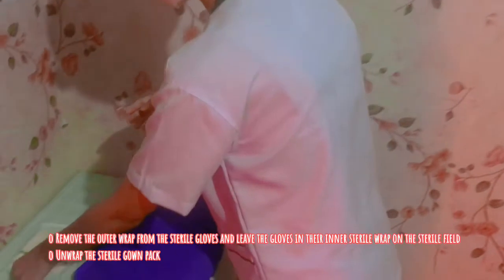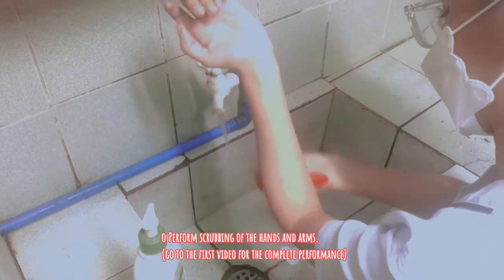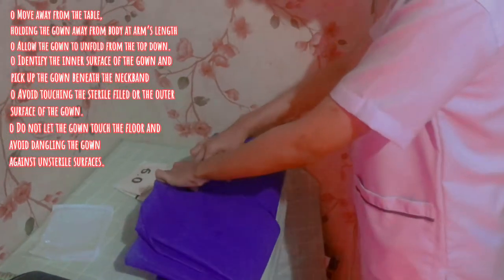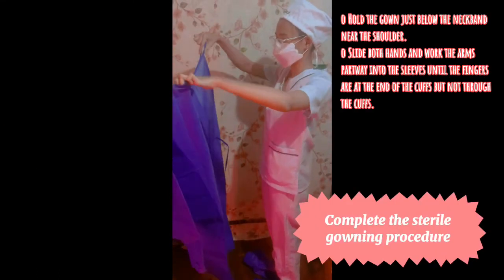The outer wrap is considered unsterile while the inner wrap is sterile. Scrubbing of the arms and hands reduces the number of microorganisms. Identifying the inner surface of the gown allows for easier access. It is also considered unsterile while the outer surface of the gown is considered sterile.